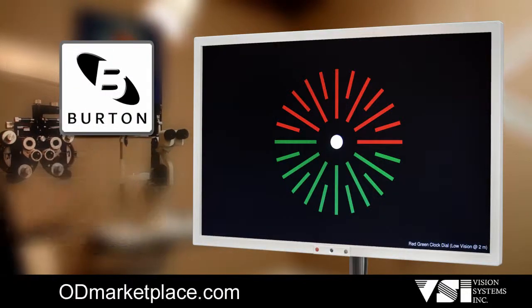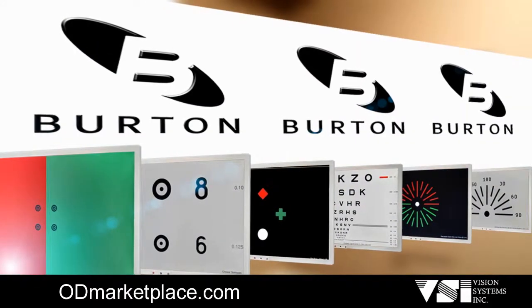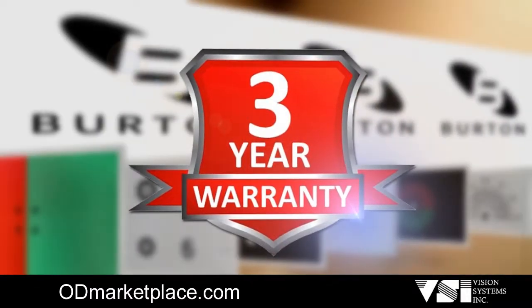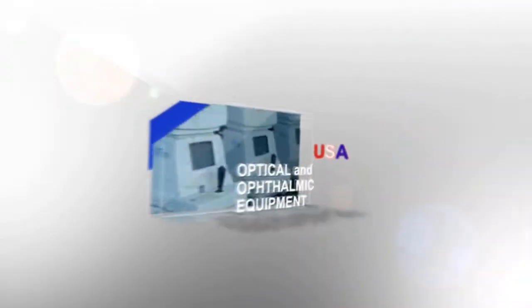The Burton Clearview 2 is built for years of reliable service. This innovative design and dependability allows Burton to back the Clearview 2 with an industry-leading three-year warranty. For well over a decade, Vision Systems Inc has also taken pride in becoming the largest reseller of professionally refurbished optical and ophthalmic equipment in the US.